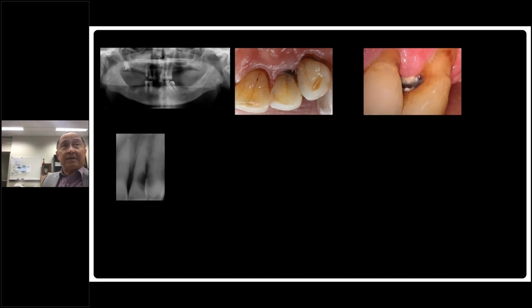If you look at the case above, a very frail 90-year-old man came to see me, and he said he just wanted to be pain-free. He doesn't want any fancy work to be done. He knows that he only needs palliative care dentistry, something to carry him through for the next 4 or 5 years. We don't know how many years at that point, but it turned out to be 5 years. And he doesn't want extraction. His medical condition will make him frailer.